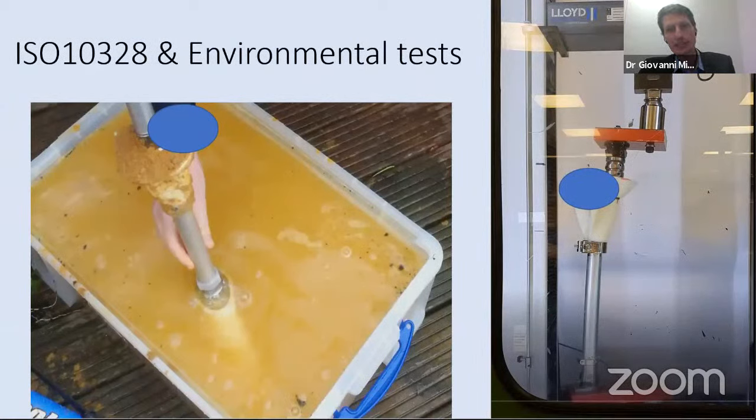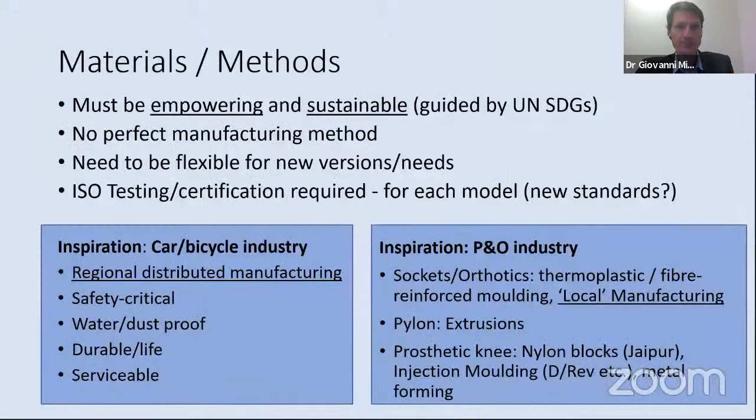Here's a few more tests. This on the right is an ISO 10328 overload test, and we've recently passed a 400 kilogram load, which is showing that the device is very robust. And we are busy at the moment with fatigue testing, which simulates 3 million steps.